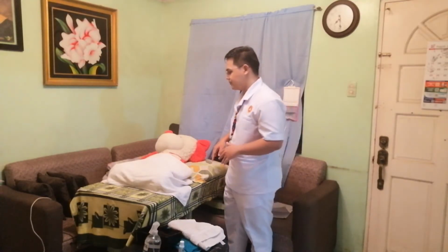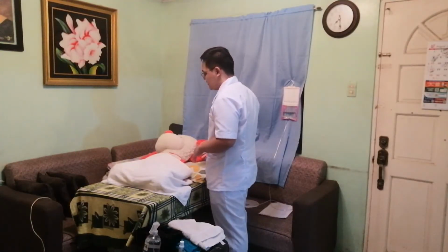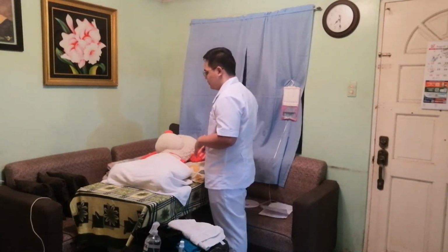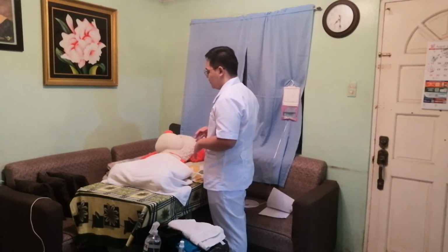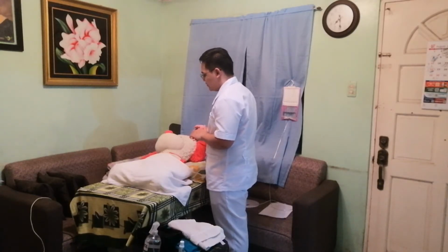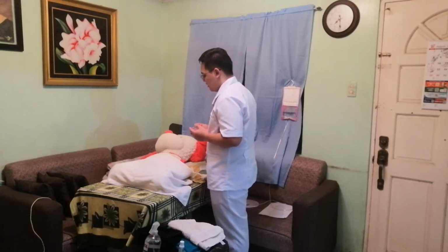Also, we will need to indicate to our client that he or she may experience the feeling of being full as we administer the enema solution. Okay, so as I said earlier po, today po we will be administering ang enema solution po sa inyo po. Is that okay? Okay, so what we are going to do po is mag-a-ask lang po sana ng consent because I will be touching po some various areas po sa inyo pong buttocks, and I will be touching it po specifically with my fingers. Okay lang po?